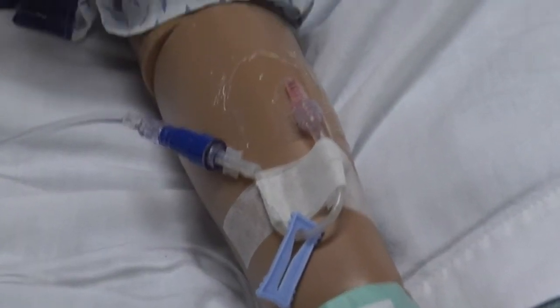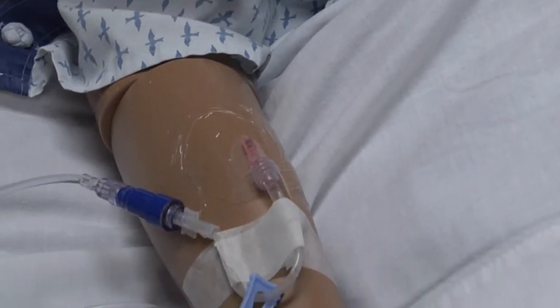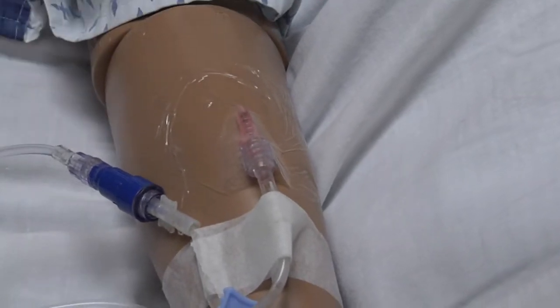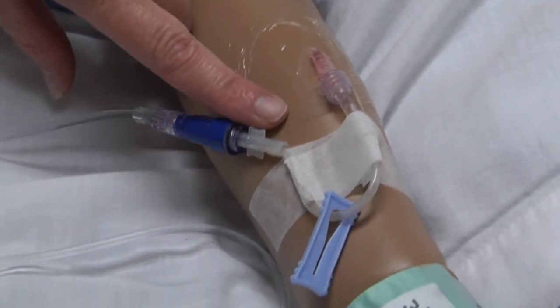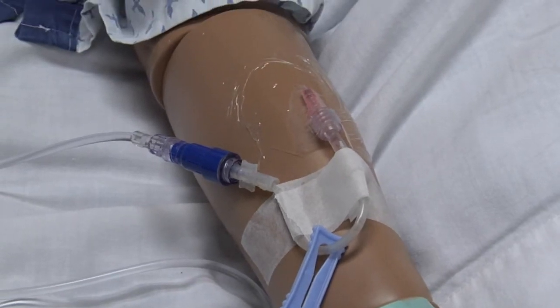And this is when we're monitoring. We're going to make sure that everything at the IV site looks good. In that case, it should be her normal skin color. It should not be tender to her at all. So I would palpate around the site and say, "Mrs. Snow, is that sore or tender at all?" And she should tell me no, that there's no tenderness there.